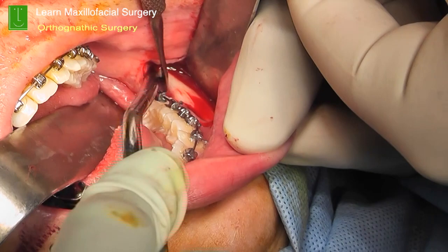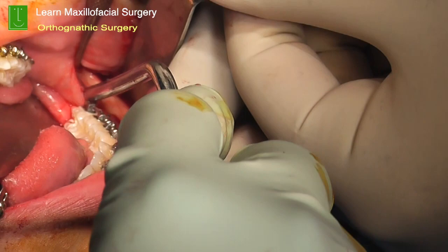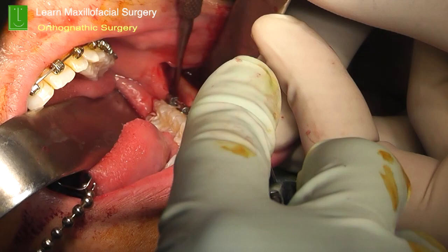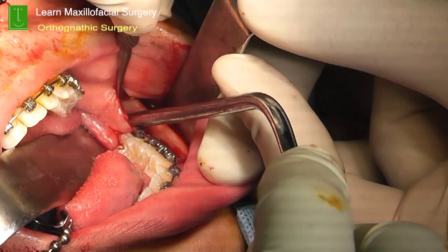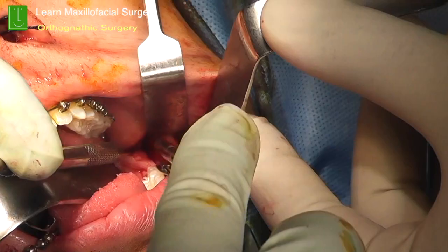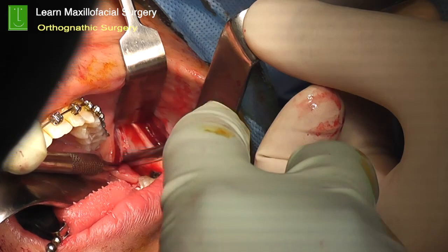Then you use the fine periosteal elevator and go towards the lingual periosteum, and again try to be in a subperiosteal plane. When you're in that subperiosteal plane, there's a nice envelope and very good access and visibility of the ramus of the mandible on the lingual aspect. This can be a bit tricky when you're raising the lingual flap. Using a bit of fine dissection helps, and that's the forked ramus retractor, which is now engaging the anterior border of the ramus. You can see the way in which the fork abuts the anterior border of the ramus of the mandible.